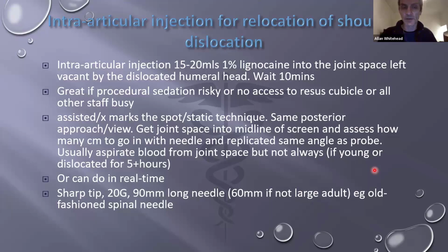I think it's a really great technique if you've got a patient that's got a lot of comorbidities, they're elderly, they're frail, and there's anesthetic risk in terms of giving them procedural sedation no matter what agent you use.